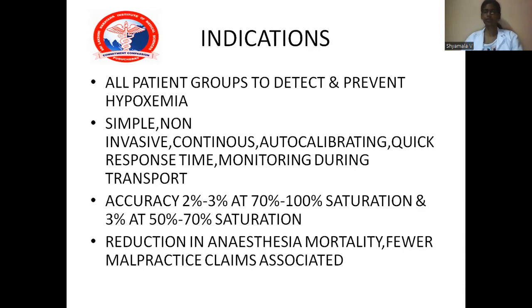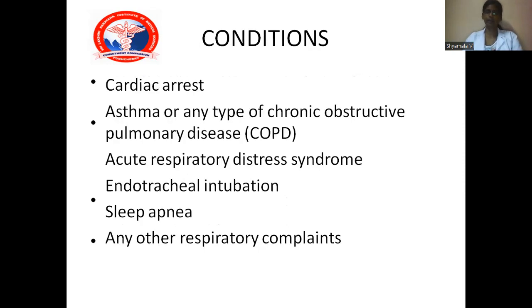It is simple, non-invasive, continuous, auto-calibrating, and has a quick response time. It can also be used for monitoring during transport. The accuracy rate is about 2 to 3% at 70 to 100% oxygen saturation, and it is about 3% at 50 to 70% oxygen saturation. And this causes a reduction in anesthesia mortality and fewer associated malpractice claims.